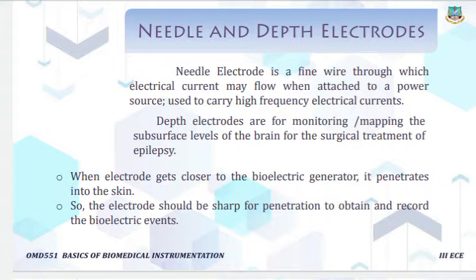This is placed inside the head, that is inside the brain, for measurements only during the operation. When the electrode gets closer to the bioelectric source, it penetrates into the skin. So the electrode should be sharp for penetration to obtain and record the bioelectric event.